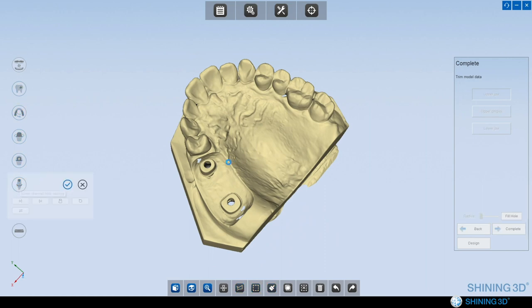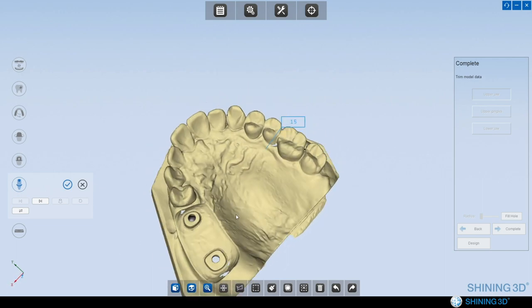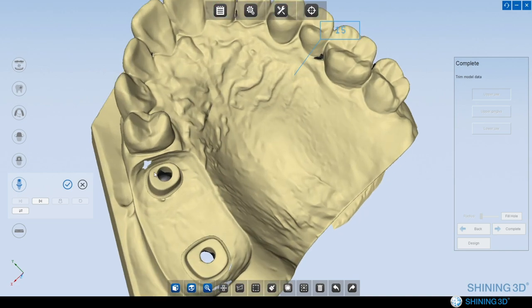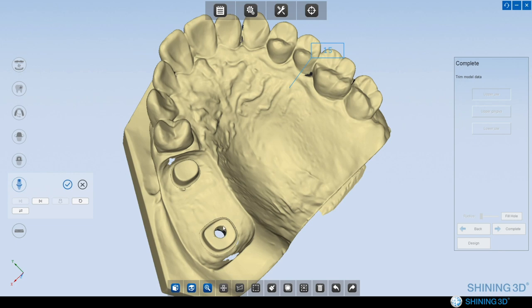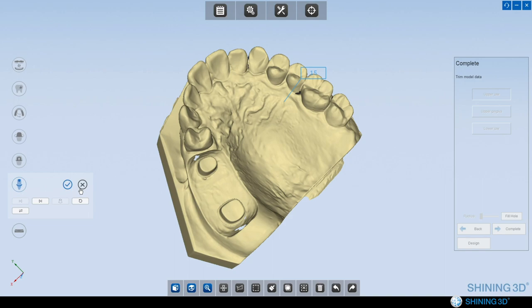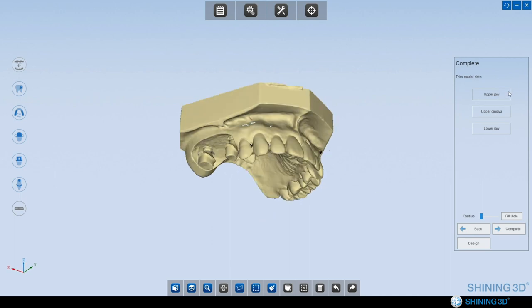Okay, here I will introduce a new function, screw channel filling. It means we can fill the screw channel in a digital way. Just click 4 points. Then click apply. Fill. Same with the other abutment. Of course, if you want, you can add points or adjust the line. Apply. See, the other screw channel is also finished. Click finish.